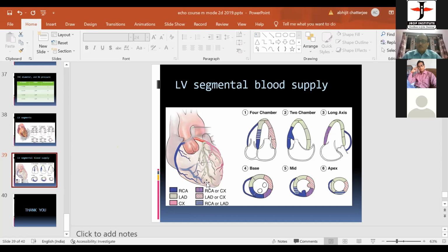Like if it's only a non-dominant RCA, then you can see only proximal RCA or right inferior septum or basal inferior septum or basal inferior wall along with RCA which is involved or right RV free wall. If it's a dominant RCA consisting of PDA also, then you will not find only the RV free wall which is hypokinetic. It will be associated with circumflex territory also. Okay, sir. Right.